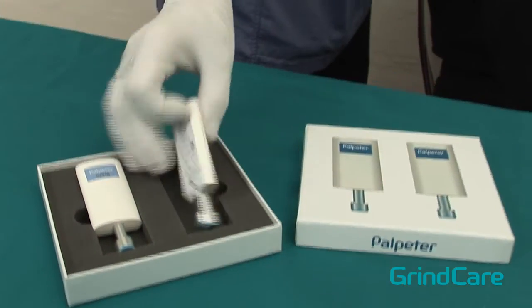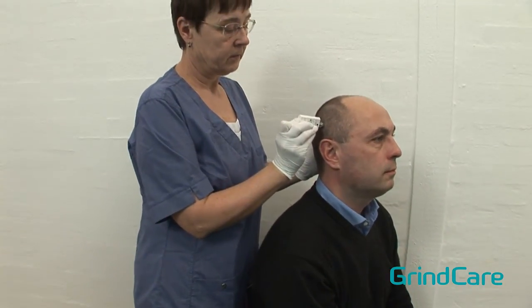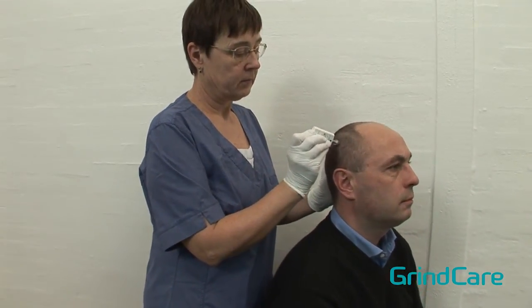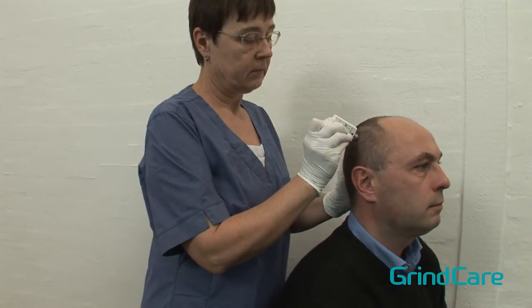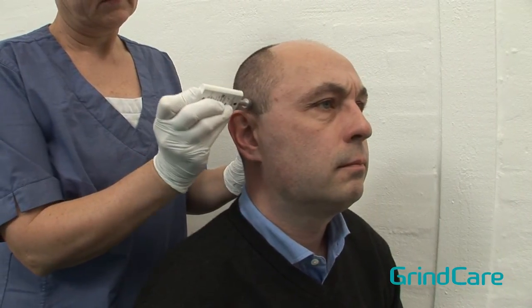To palpate the temporalis, use the 1000 gram or 2 pounds of pressure version. Ask the patient to lightly clench their teeth together to locate the muscle. Start in the posterior region and move forward to the middle temporalis and then the anterior temporalis.